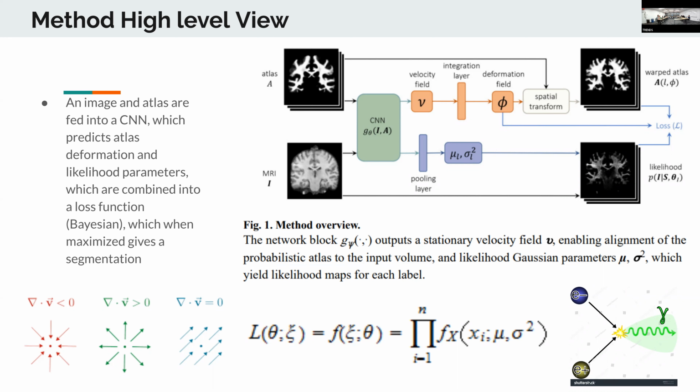It's still argmax, right? It's still labeling each voxel as a segment. Well, but it takes an atlas in standard space and warps it into this specific subject space. So it's not just semantics. You can say, oh, this is unsupervised, like this is segmentation, but the problem is different. It kind of depends on if you think that, for example, we have a lot of atlases already. It's a very constrained problem, and I don't blame them.